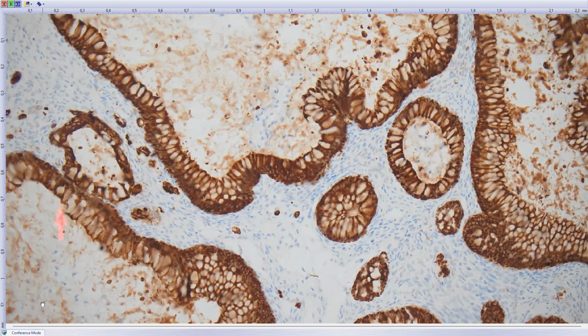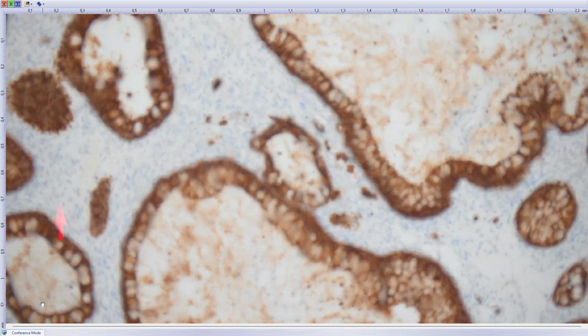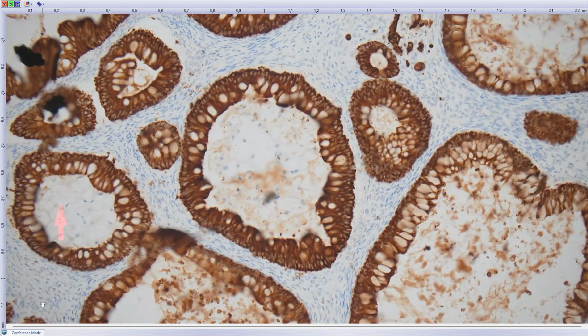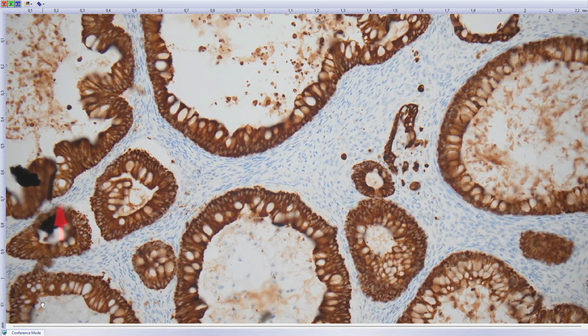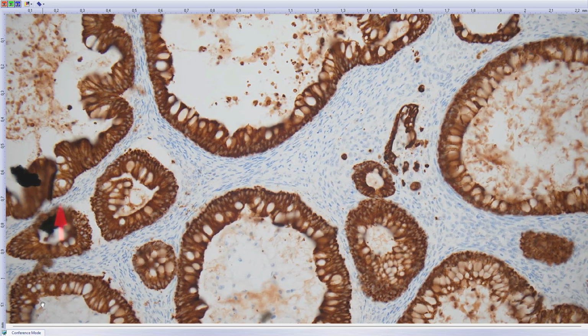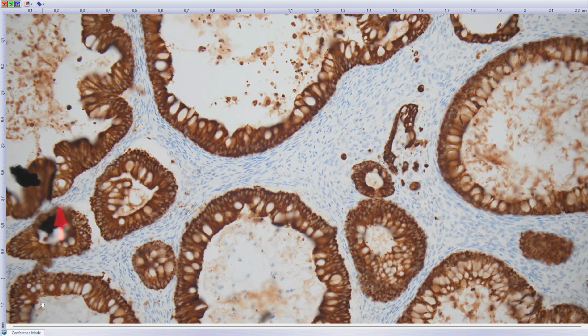These small cells. All these foci were smaller than 10 square millimeters. They say that when it is smaller than 10 square millimeters, it usually behaves in a benign way. But still, I would call it intestinal type mucinous cystic tumor of borderline malignancy with foci of microinvasion.